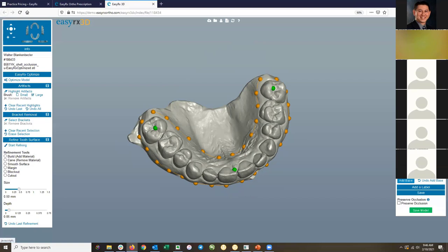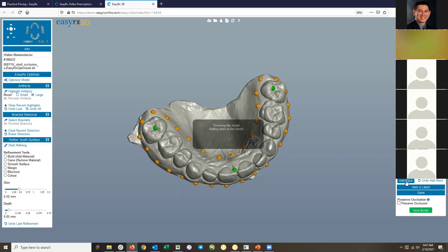Next are the base options: you can do a regular base or a hollow base. This time I'll do a hollow base. You can choose your base height - default options are 2mm, 6mm, and so on, or you can customize it. With hollow selected and a base height of 4mm, you next choose your wall thickness - how thick the wall will be when hollowing the inside. I'll choose 2.5mm. I'm also turning on options for drain holes and chamfer base. Now hit Add Base - this takes roughly 15-20 seconds for a hollow base.